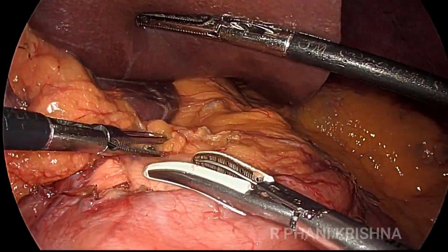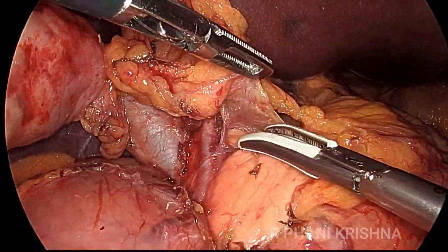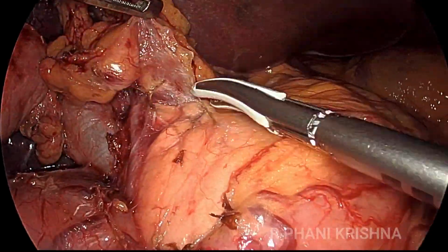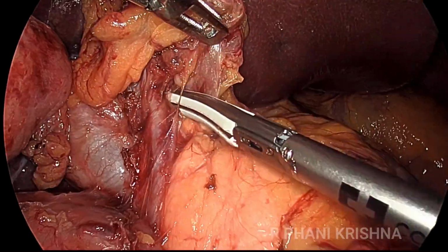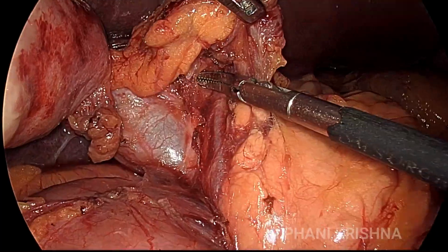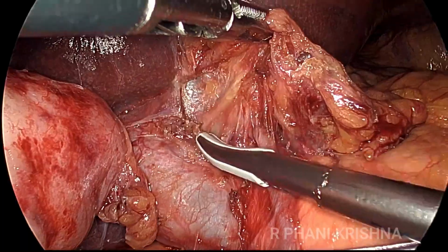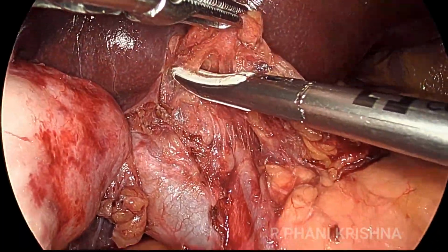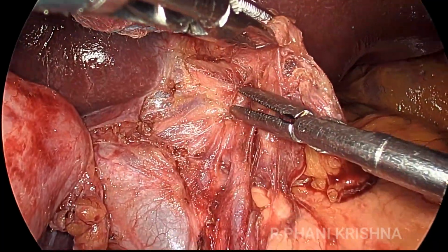So that's the gastrohepatic omentum being divided. That's the common hepatic artery lymph node being dissected and lifted off. Once we see that, we can see the area where the common hepatic artery is dividing into the proper hepatic and the gastroduodenal artery. Once we identify that, we work on the surface of the vessel, and progressively now we are dissecting off the fibrofatty and lymphatic tissue of the left hepatic artery and the proper hepatic artery.